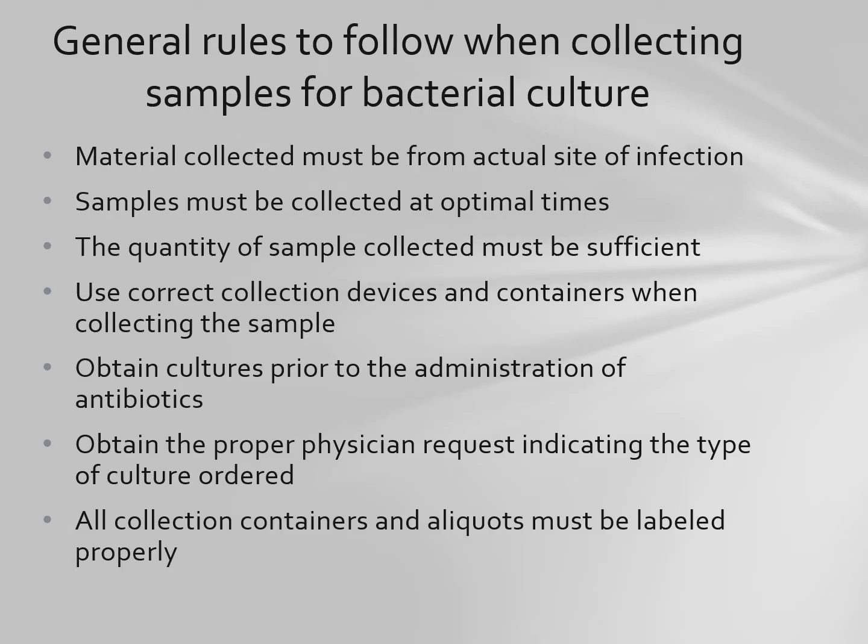Now, anytime you collect samples for microbiological testing, there are some general rules that we want to follow for collecting that culture material. The culture material must be collected from the actual site of infection, and not contaminated by any surrounding material. The samples have to be collected at optimal times, so we have to consider the pathophysiology of the disease, etc. Something like urine cultures have to be collected in the first morning sample.